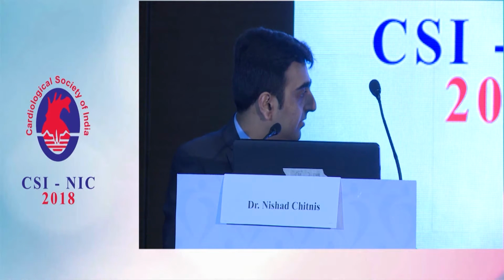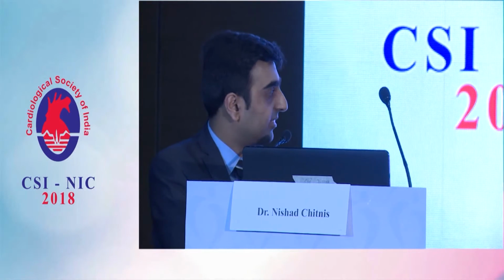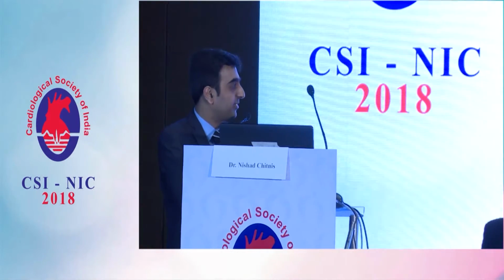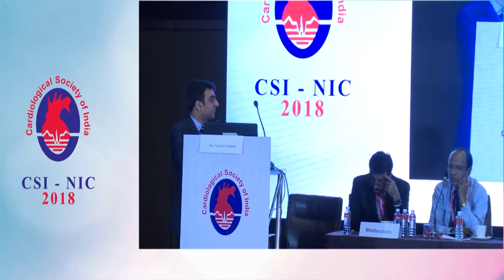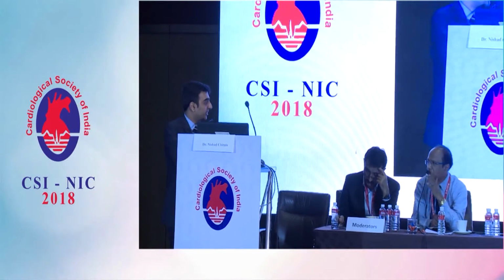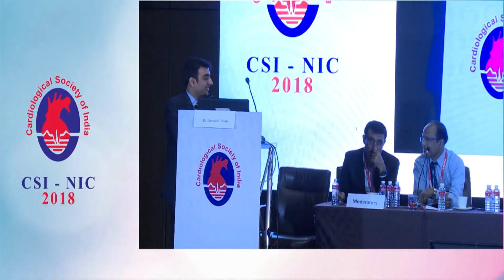Excuse me, you could have put a new wire and a new balloon and crossed. We tried balloon crossing a wire, sir. The wire we were not able to cross. Tried for almost 15 minutes to get a wire across it. The balloon was partially inflated. The wire just did not cross it. So we had to try something else. Finally, when we got the snare, we were able to get some benefit, some pull-on, and then finally we were able to trap it. We were lucky. It's very difficult to get the snare. Yeah, we were lucky, true.